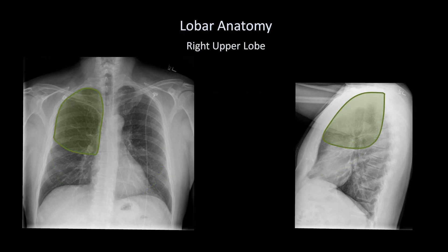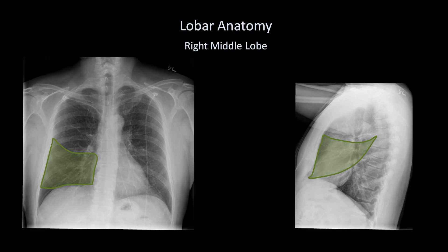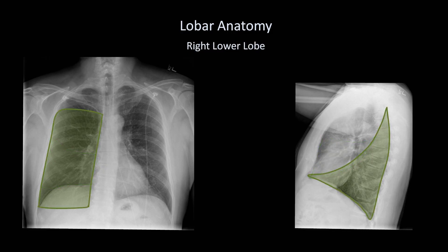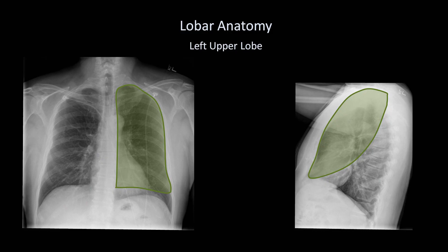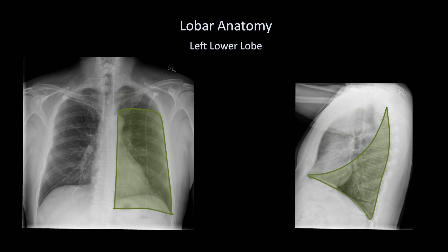The right upper lobe is located here, and the right middle lobe, most notably making a wedge shape as seen from the side. The right lower lobe not only comprises the most inferior portion of the lung, but most of the posterior surface as well, frequently extending up as high as the aortic arch. Then the left upper lobe, which anatomically would probably be better described as the left anterior lobe, and the left lower lobe, which would be better described as the left posterior lobe.